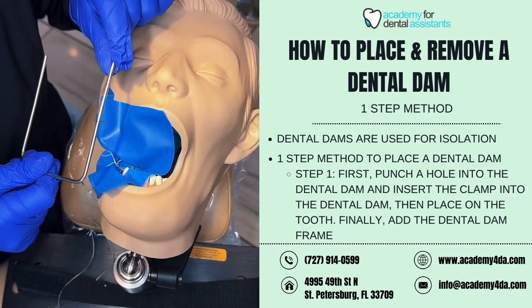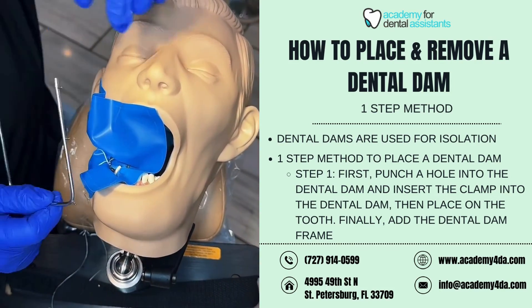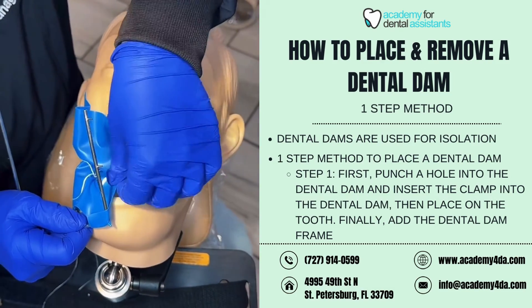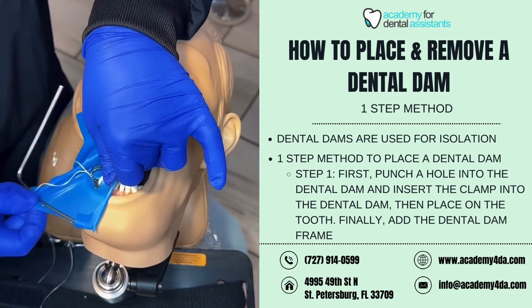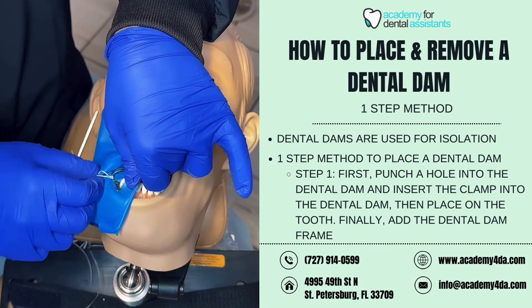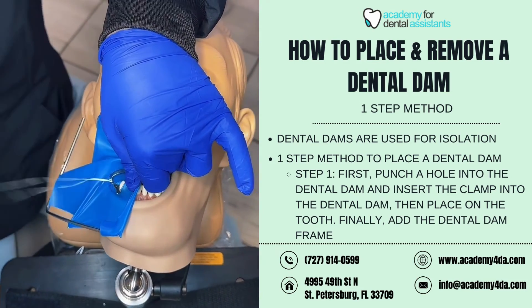Now I'm going to place my dental dam frame. Using the prongs or projections on the frame, I'm going to pull the dental dam taut around them — stretch it — and this is what's going to help us create that isolation. Be careful that you're not pulling too tight, as you don't want your dental dam to rip.